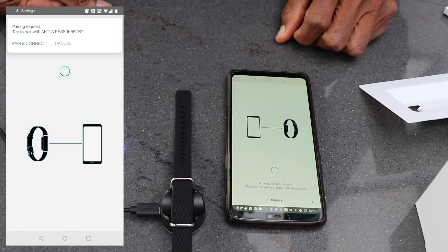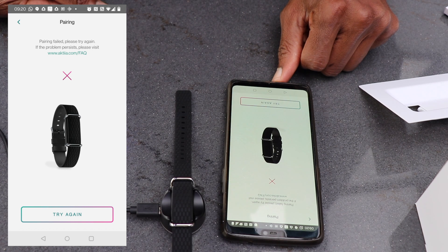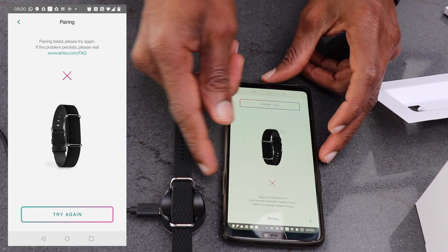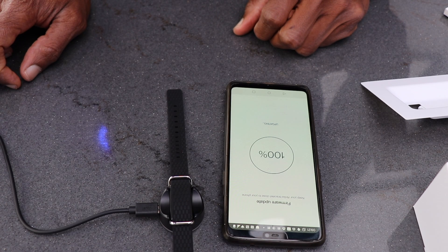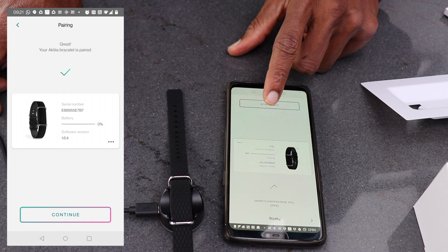The setup instructions are fairly easy and straightforward, so I had no problems with that at all. The first pairing attempt failed so I tried again. Then the system starts to do a firmware update. Firmware update completed. The wristband is now successfully paired with the app.